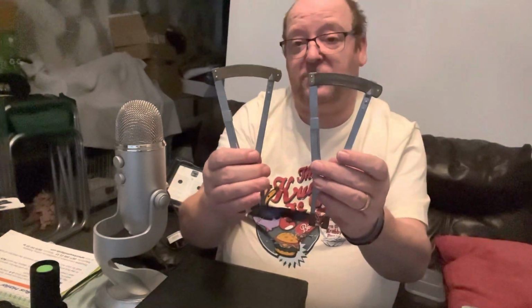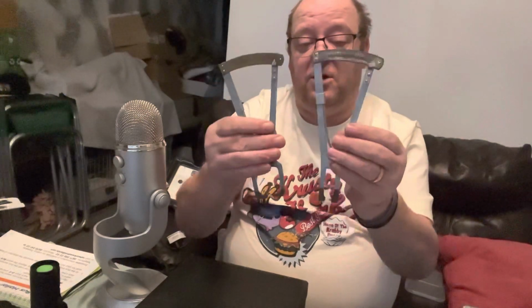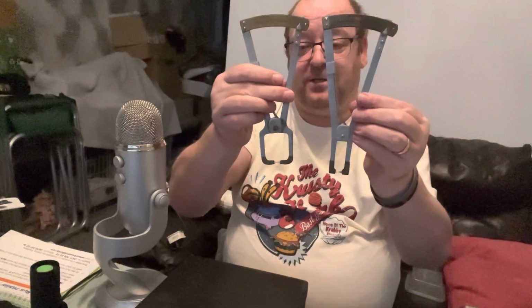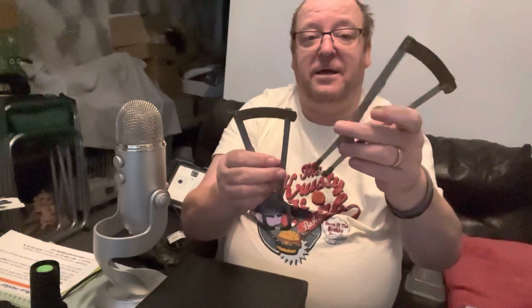My next instruments, I've got two of these, and these are for checking the centre thickness or the edge thickness of a lens. You will notice, although they're very similar, they are very slightly different. So this one has got quite a narrow base. And to work it, you would literally push that, and as it comes back against the lens, it'll stop up there and it'll show you the thickness. This works in exactly the same way.